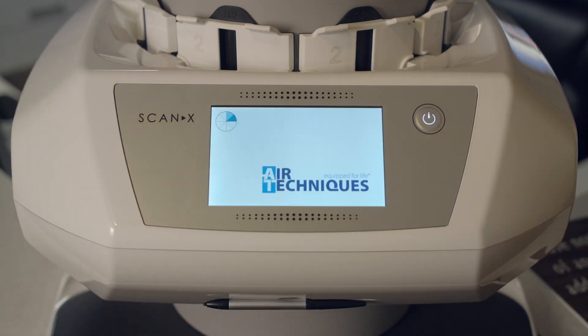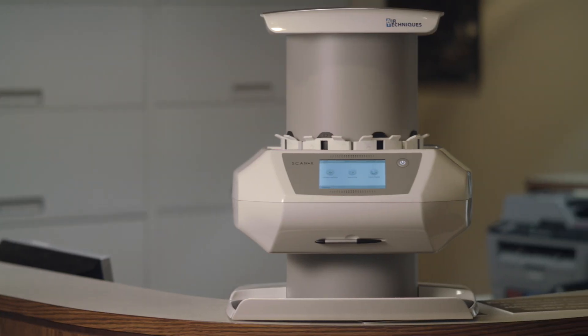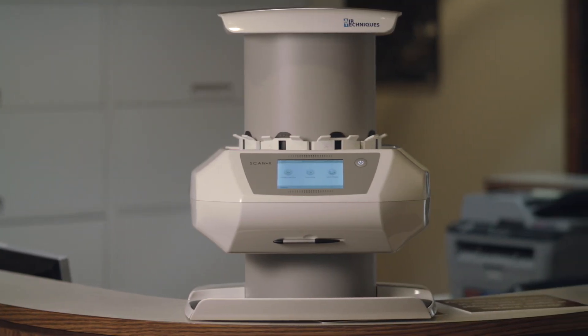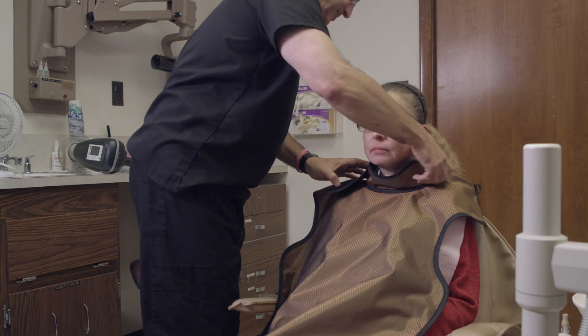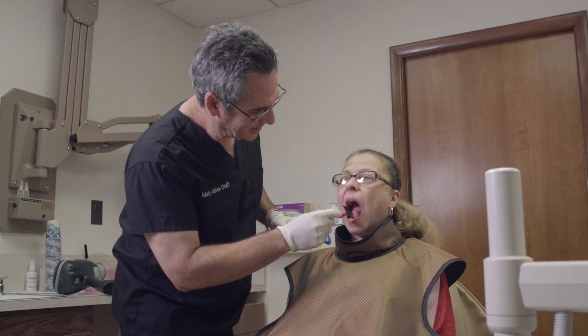One powerful tool we have in our operatory is the Scanex Intraoral View by Air Techniques. We've been using digital radiography in my office for many years, and phosphor plate technology is just one of the pieces of that puzzle. Here are some reasons that I like the Scanex Intraoral View for use in my office.